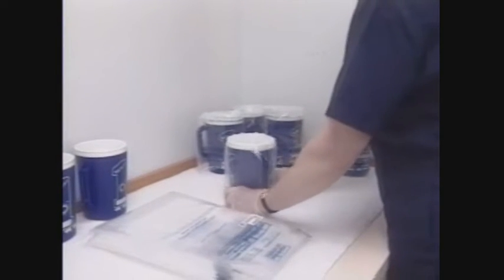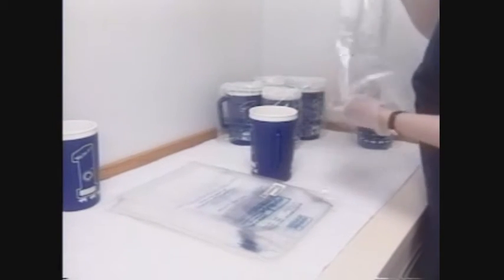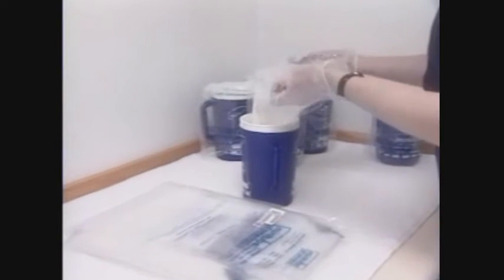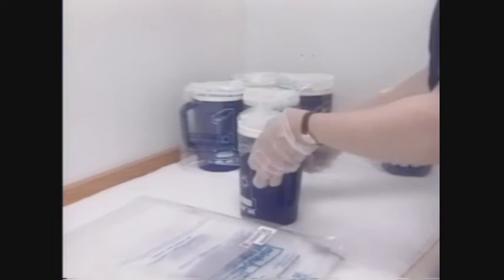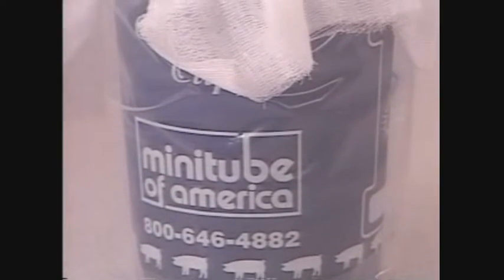Here, the universal semen bag is being fitted into the insulated collection vessel. Notice the filter is incorporated into the universal semen bag, and these bags are available pre-sterilized. As the top of the collection bag is pulled down over the outside of the collection vessel, the filter opens in a funnel shape. A rubber band is not required. Non-woven filters and woven gauze can be used with the original mini-tube plastic collection bag. These are held in place on the collection vessel with rubber bands and can be used singly or in multiple layers. The collection equipment must be assembled and ready for use before the boar is introduced into the collection pen.